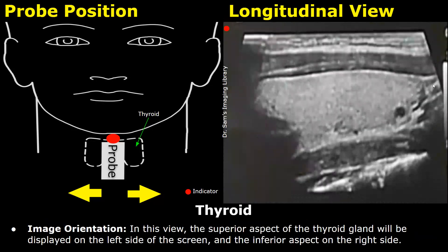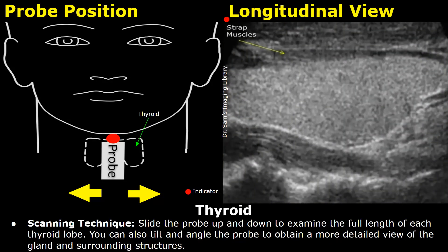In this view, the superior aspect of the thyroid gland will be displayed on the left side of the screen, and the inferior aspect is seen on the right side. These hypoechoic areas are the strap muscles. Slide left and right to examine each thyroid lobe individually in the longitudinal plane, and you can also slide up and down to examine the full length of each lobe.